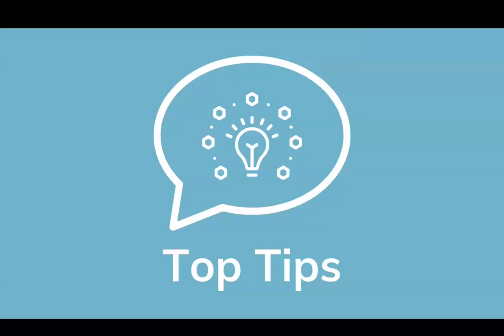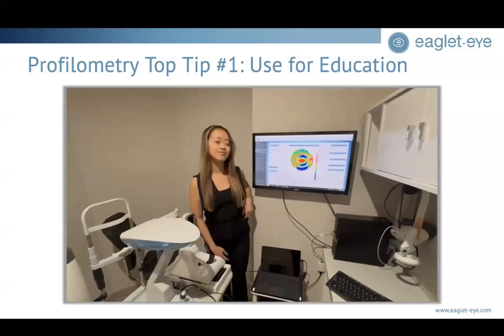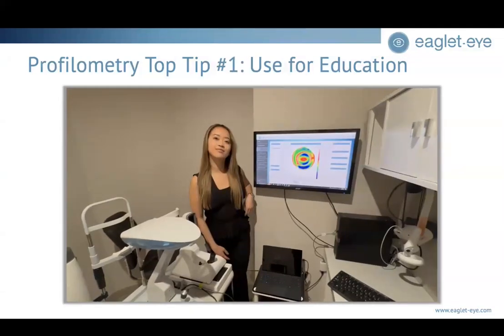I want to take a second to mention some top tips. So here are 3 top tips. We're going to break away from going through product stuff, because that's very important and I wanted to share it with you, and I want to spend some time at the very end to answer more questions about the ESP specifically. We've got some folks, as you know, Ted and Elaine, here to answer questions, but I want to get into the clinical side and share my top tips, 3 things that come to mind for me in the clinic when it comes to working with our lab.